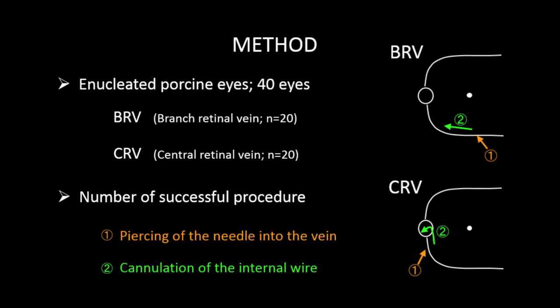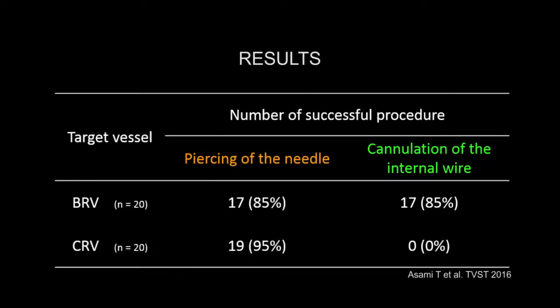We tested the device for its efficacy in the branch and central retinal veins in 20 enucleated porcine eyes for each vein type. The needle pierced the vein at a distance of four disc diameters from the disc in the BRV group and at one disc diameter in the CRV group. The internal wire was cannulated toward the disc, and particularly in the CRV group, the surgeon attempted to guide the wire into the central retinal vein of the optic disc. The success rate of needle piercing was high in both groups, whereas the success rate of cannulation was high in the BRV group. However, the wire could not reach the central retinal vein in the optic disc in the CRV group.